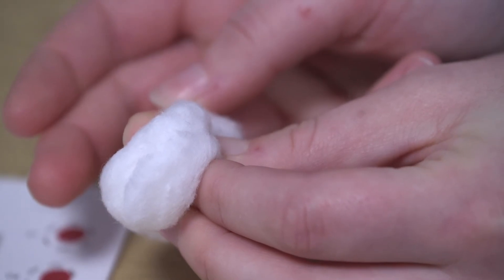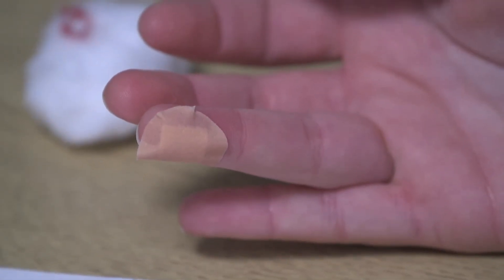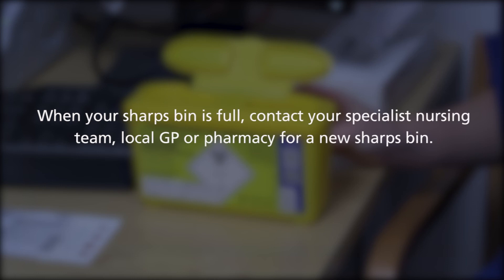Once you have taken the sample, place cotton wool and a plaster if necessary onto the area where blood was taken from. Dispose of the lancet into the sharps bin. When your sharps bin is full, you can contact the specialist nursing team or your local GP or pharmacy for a new sharps bin.